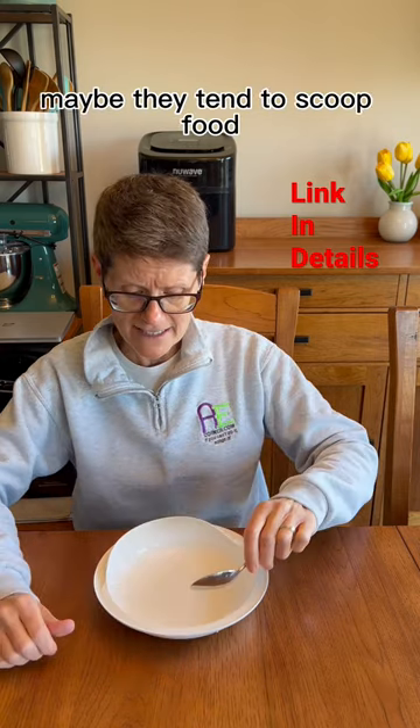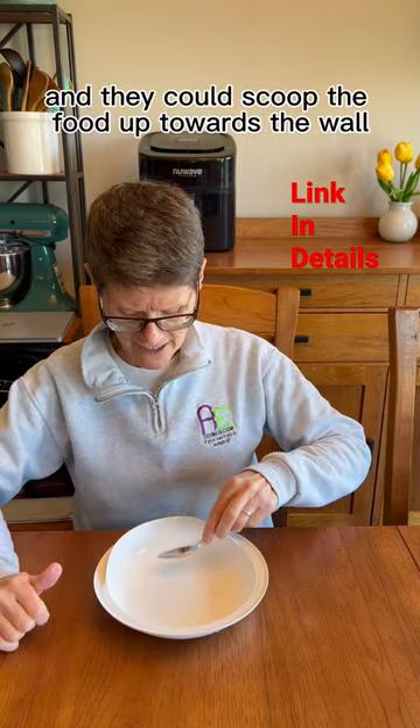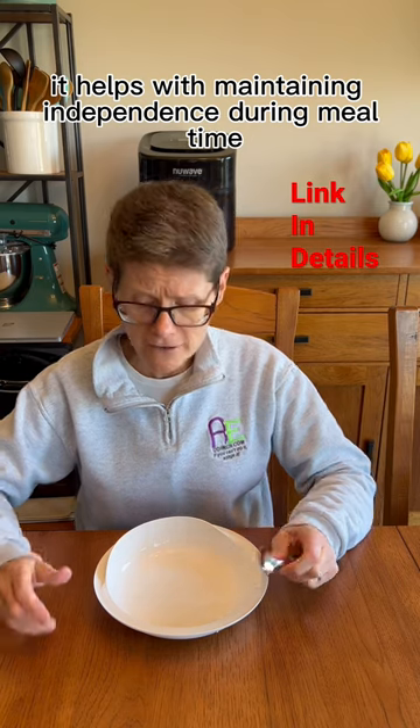Or maybe they would like to — maybe they tend to scoop food — they could put the lip towards your loved one and they could scoop the food up towards the wall and let it collect on the spoon. It helps with maintaining independence during mealtime.